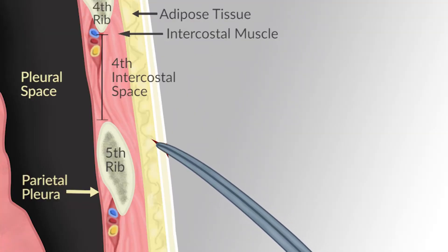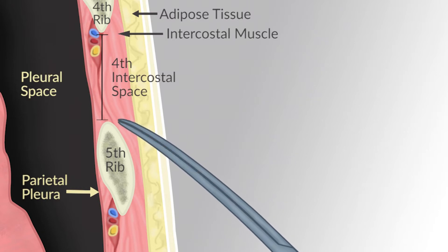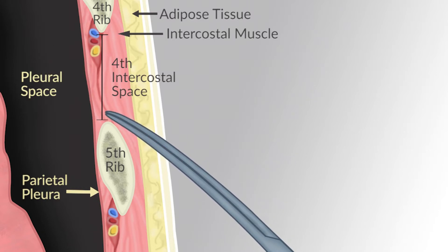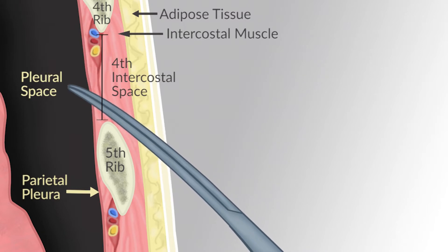Dissect the tissue with the Kelly Clamp, tunneling to the 4th intercostal space. Close the Kelly Clamp and apply pressure over the superior aspect of the 5th rib until the clamp punctures through the muscle and parietal pleura. Appreciate the sudden loss of resistance.